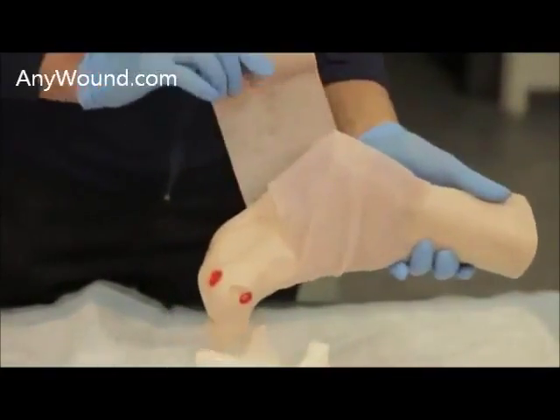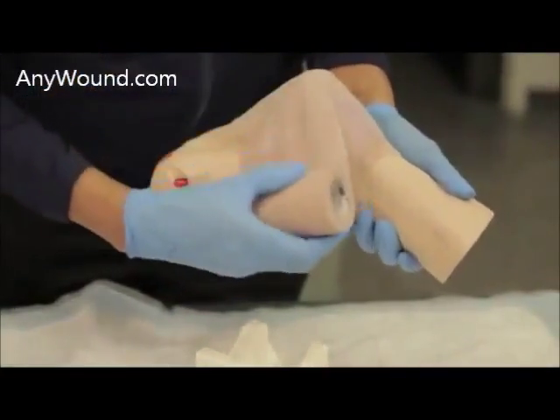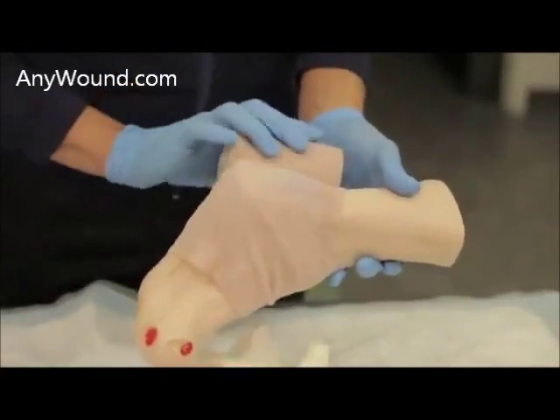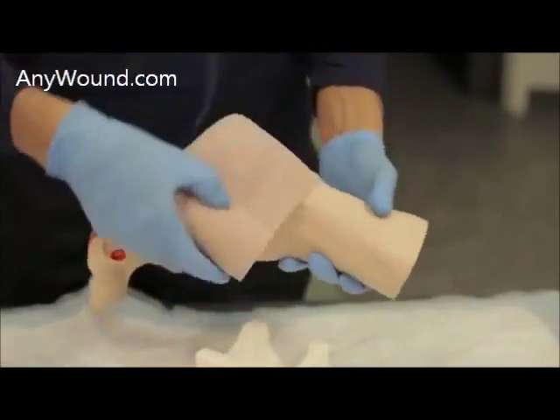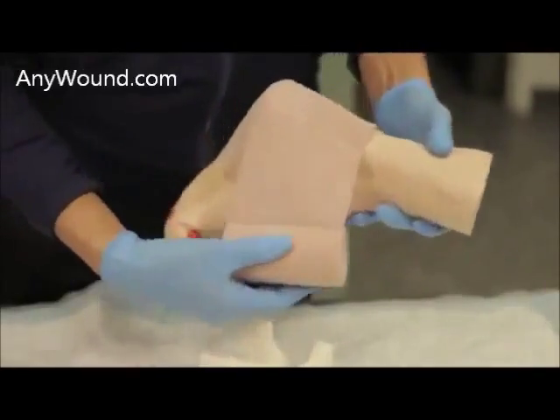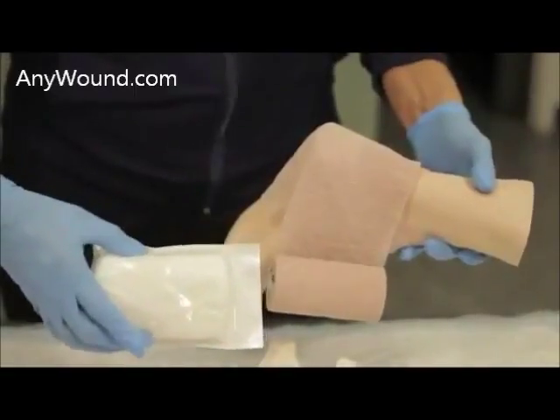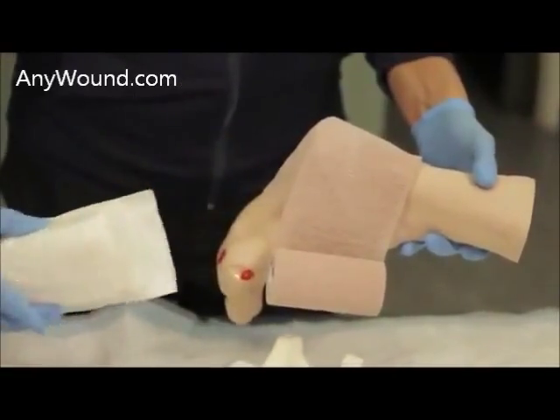There are other items that can also be utilized for securing. For certain diabetic patients with some compromised flow, instead of using Coban, you could also secure with a Curlix — a cotton wrap — and then secure with tape.